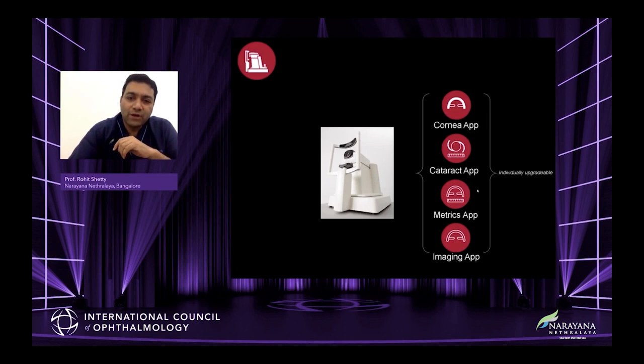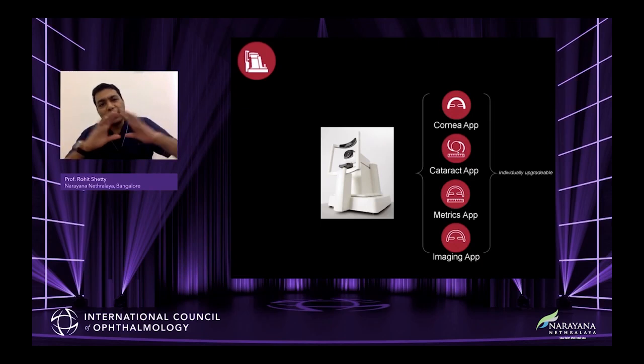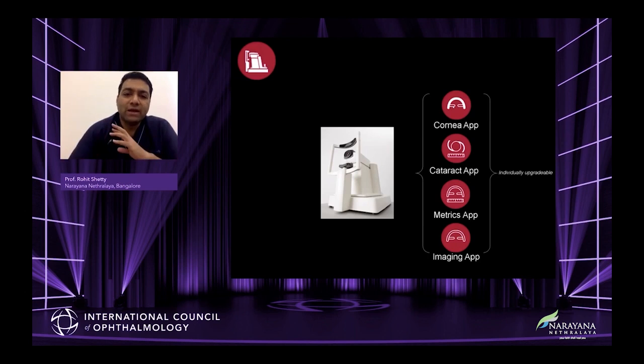The complete biometry would be done, and after that, you have a range of options, depending on what kind of eye you are looking at. If the patient has keratoconic eyes, I would consider that out of 500 patients we see, around 6 or 7 have keratoconus on topography, which the patient has never known, or ophthalmologists have never picked up. So you can look at it and say, that's a keratoconic eye, so I choose the kind of formula I want, or it could be a post-refractive one.